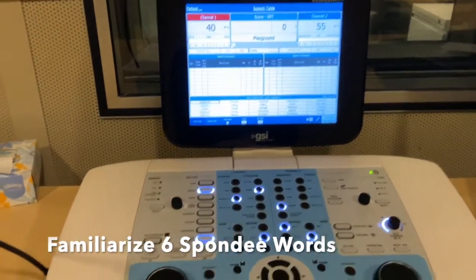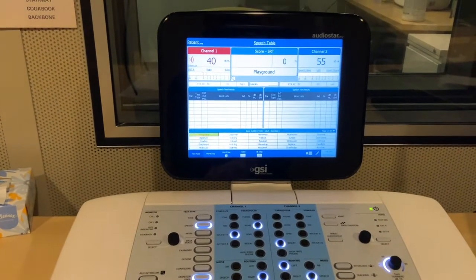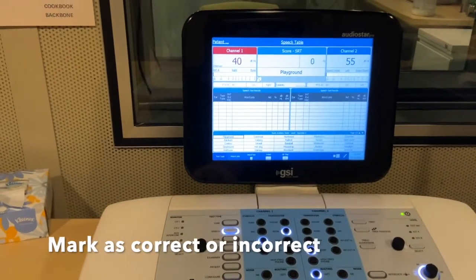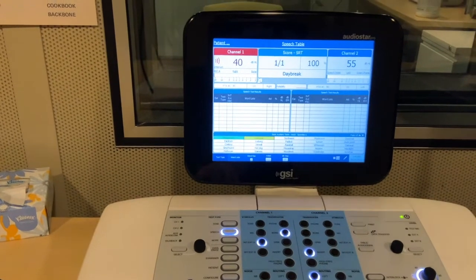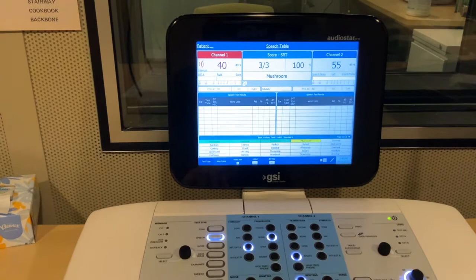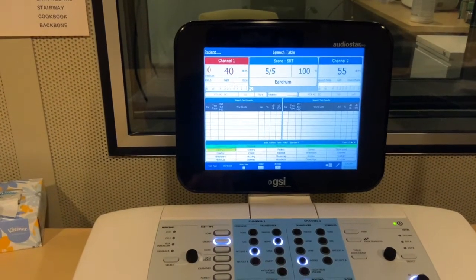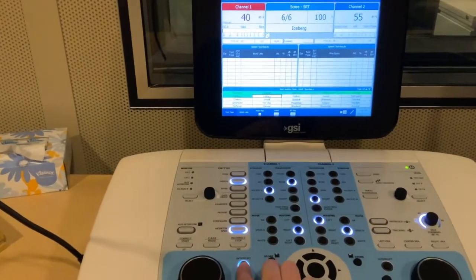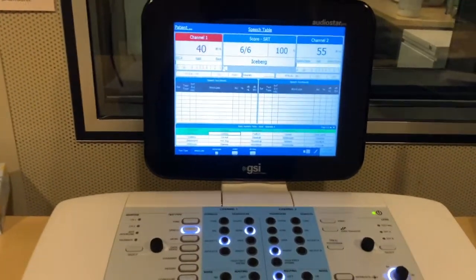It'll start playing, and they'll say playground. And you can say whether it was right or wrong. All right, so make sure that you stop hitting interrupt so that it does not play over the 6 words.